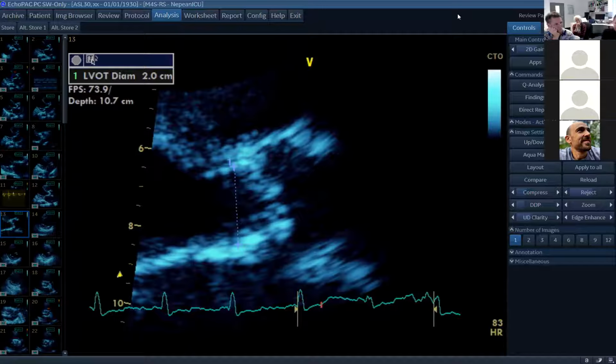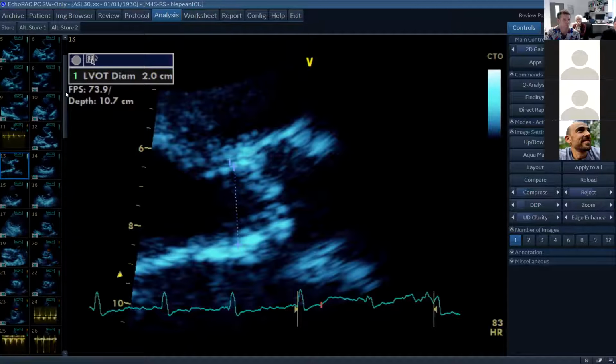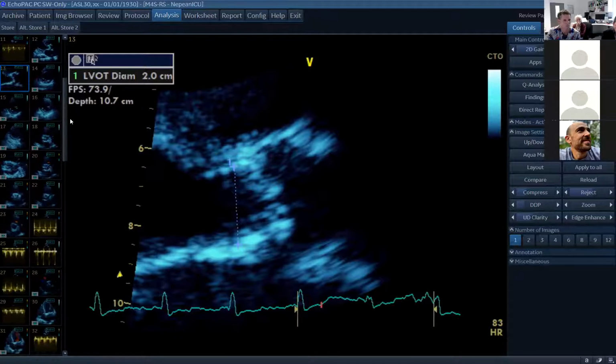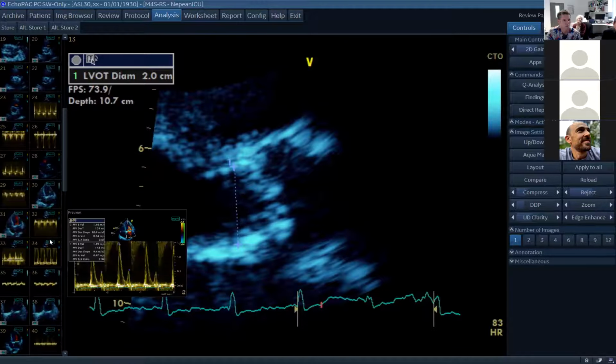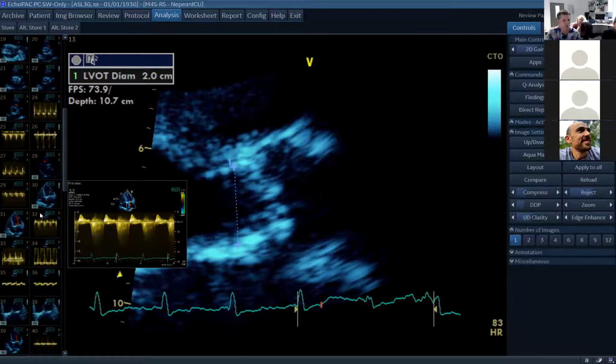Without seeing it live, I can't be sure that that is the right place, but this is where most of the measurement error comes from, because it gets squared when you're measuring the aortic valve area. Very nice. All right, so what do you want to do? If you're worried about aortic stenosis, what do you want? Do you want this continuous wave Doppler?